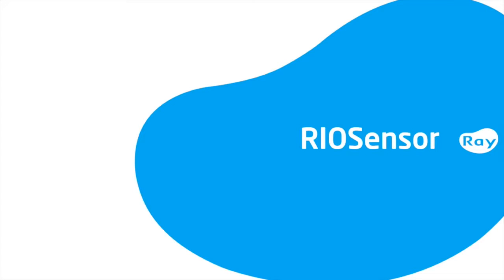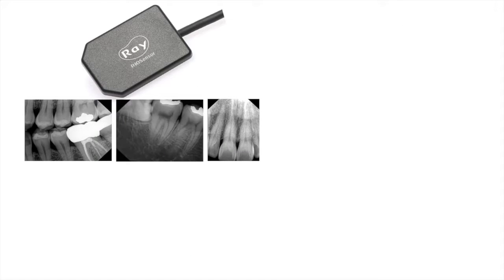Welcome to the RIO sensor training video, and thank you for choosing RIO sensor as your dental x-ray sensor solution. The purpose of this video is to learn about the basic fundamentals of the sensor and RIO view imaging software.